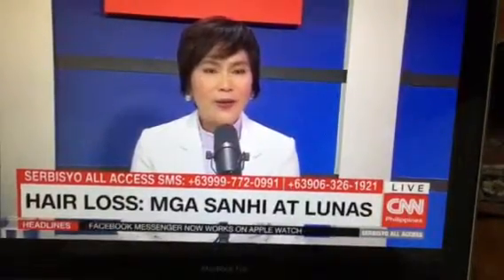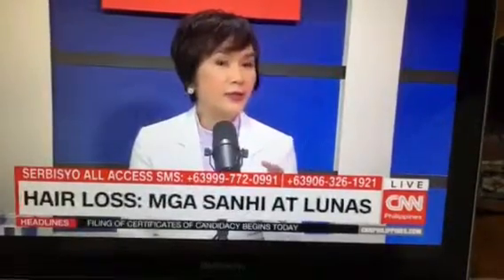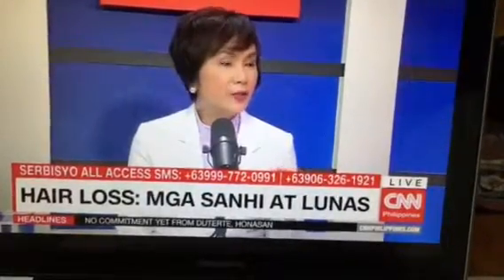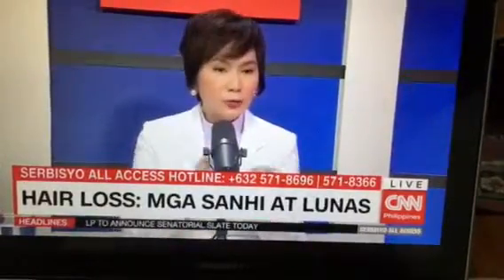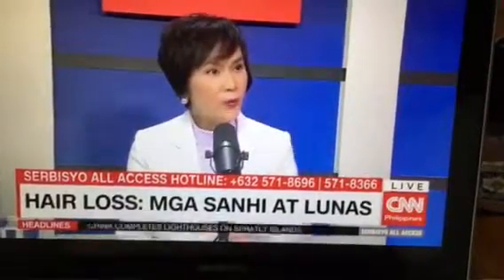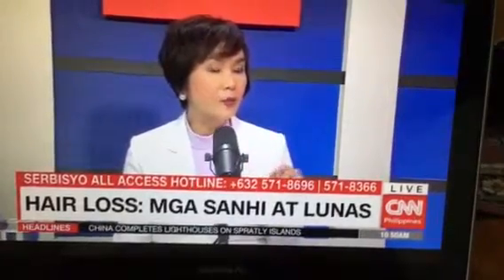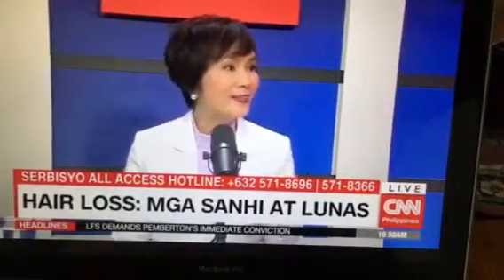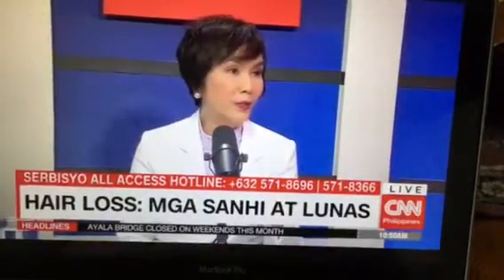Okay. There are two ways to do hair transplantation. I do both strip and follicular unit extraction. In follicular unit extraction, I use a machine to extract the hair individually. And that's one part of the whole procedure, kasi maraming steps on procedure. And one step is to extract the hair. That is where you use the robotic.